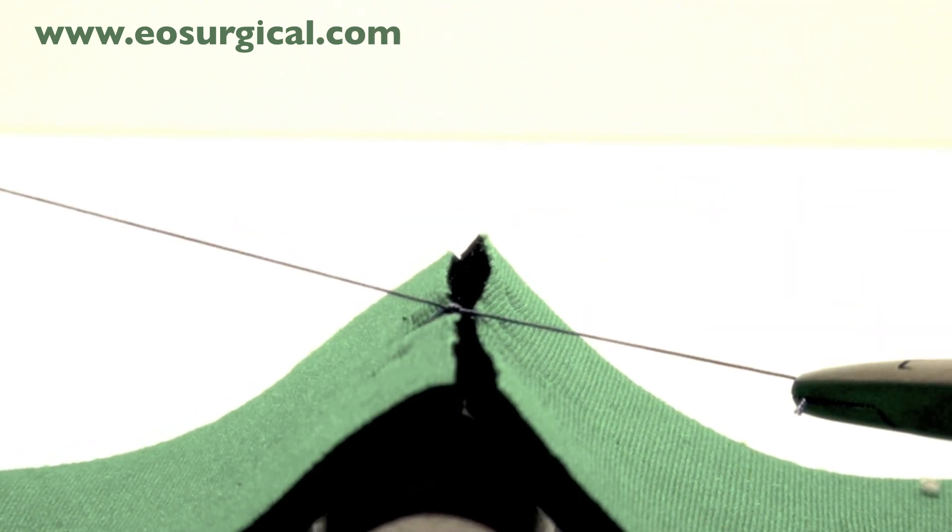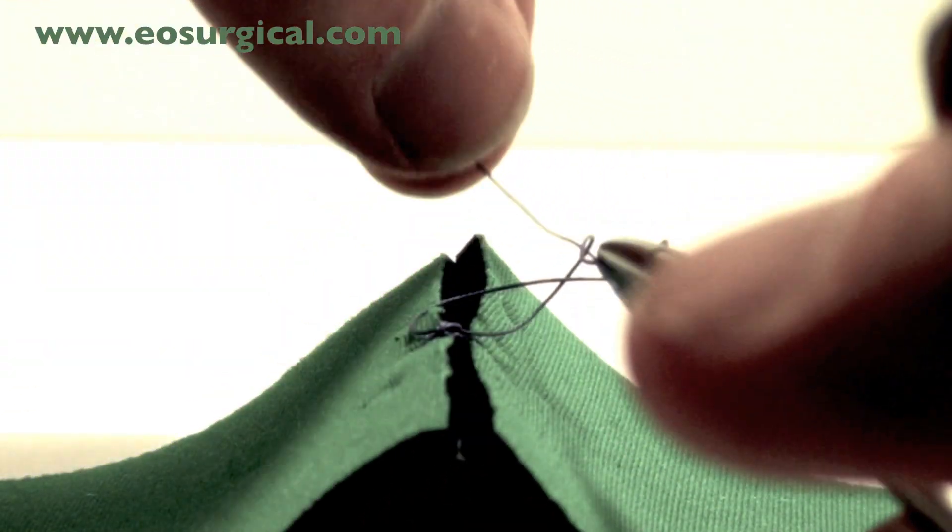Now here are just some close-ups of knots being formed. All of these are resulting in a reef knot, which is the most secure type of knot you want to have in this situation.